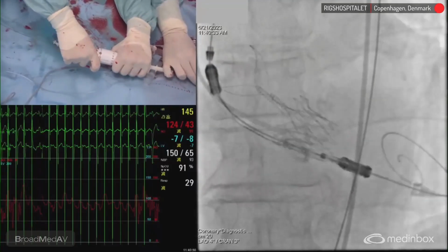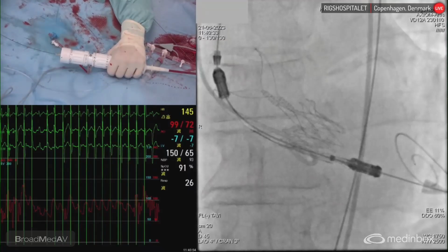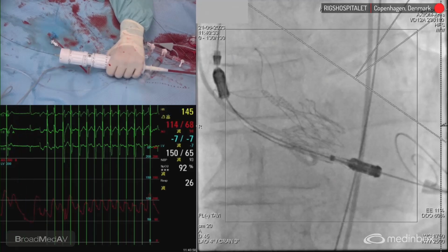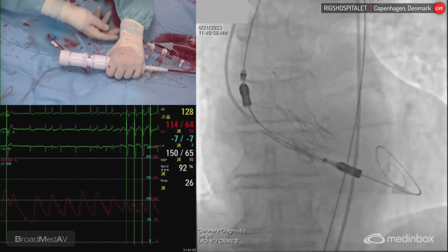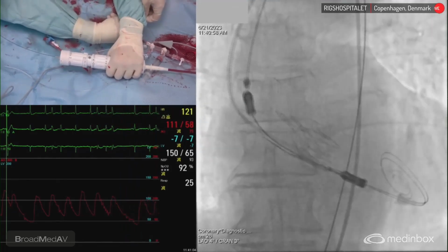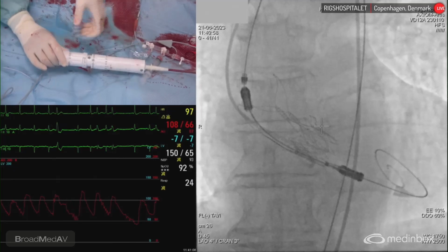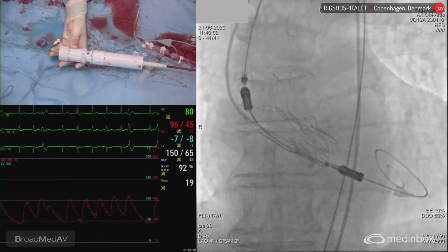Quicker. All right. Very constrained, but we have to be careful. Stop pacing. Stop then. We have to be super careful now. Take it out. Or do we think we even cross now and go with the balloon? But that's maybe preferably not. Let's see. And I'm a bit surprised because we're not in the cusp overlap view.